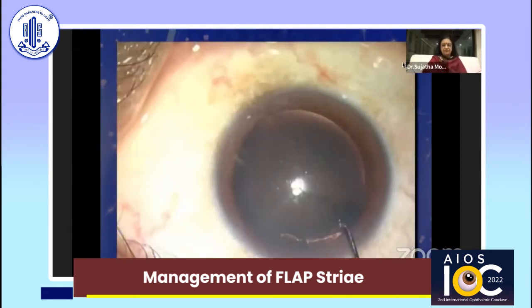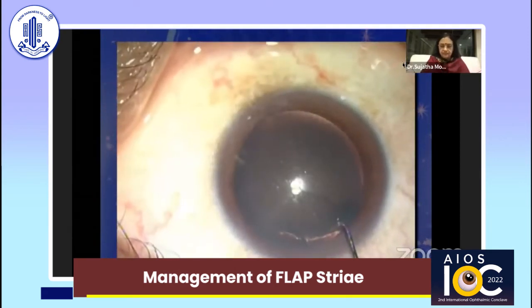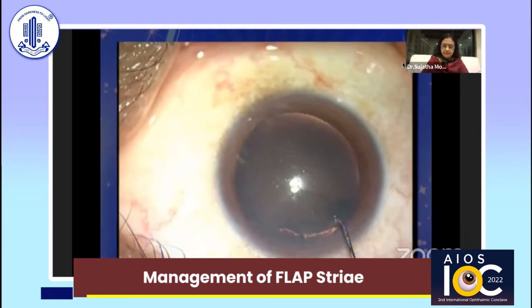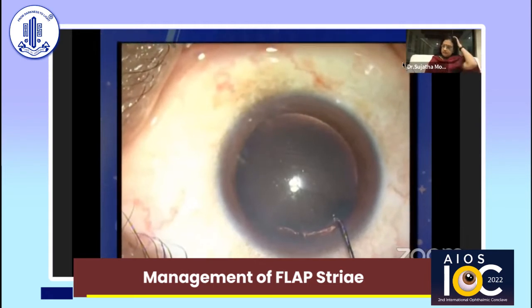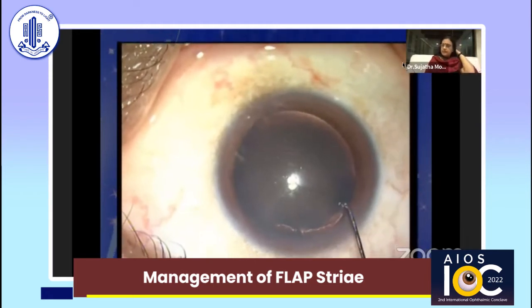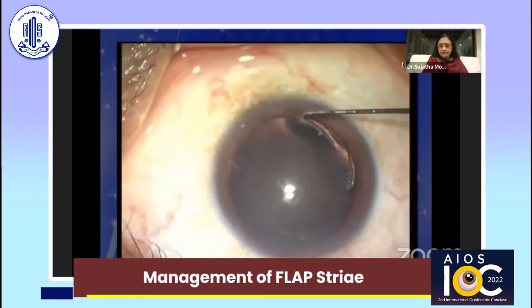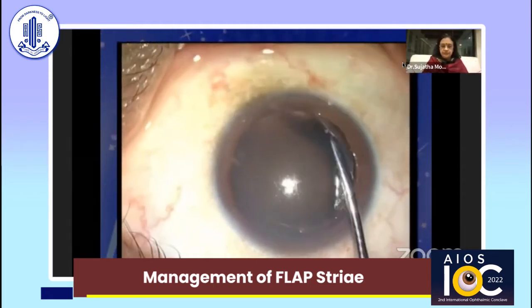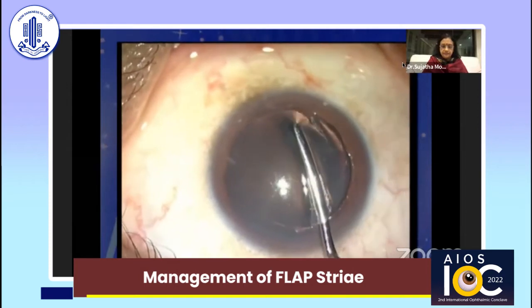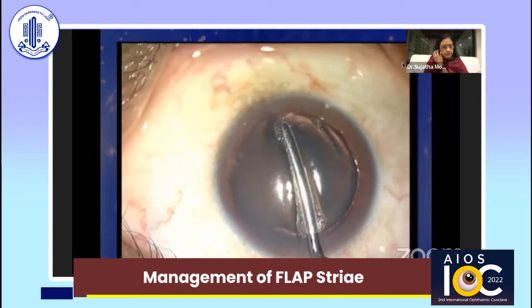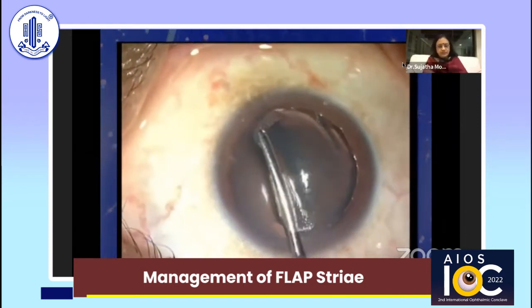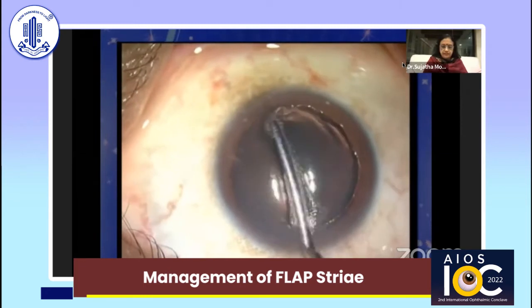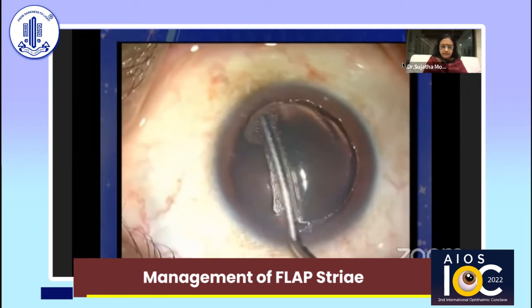In the first case, the pupil is dilated for a good transillumination effect on the striae. The flap margins are identified. The Sinski hook is used to break the epithelium. The flap is then lifted and floated on the bed.